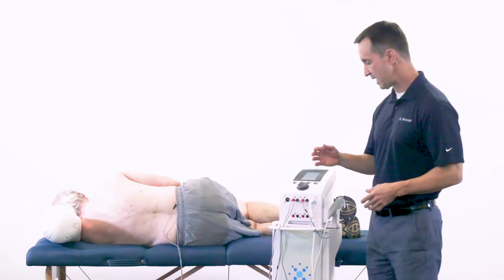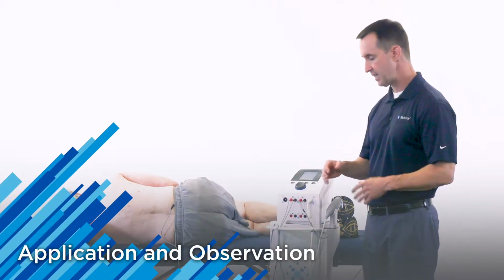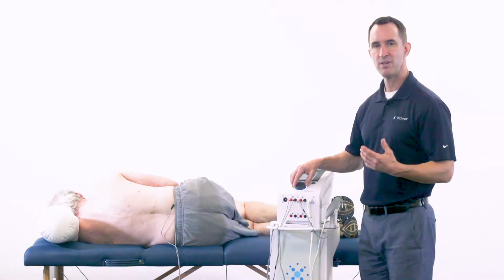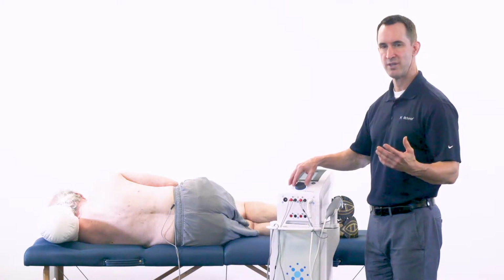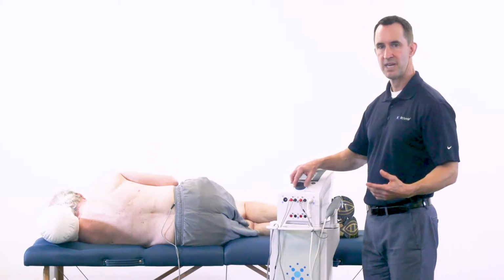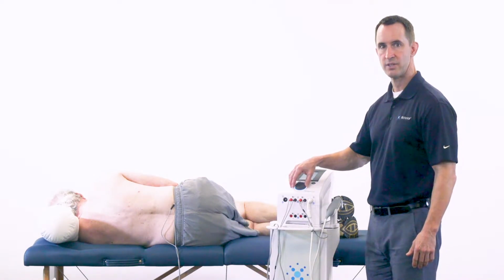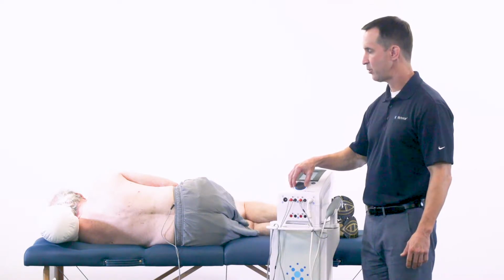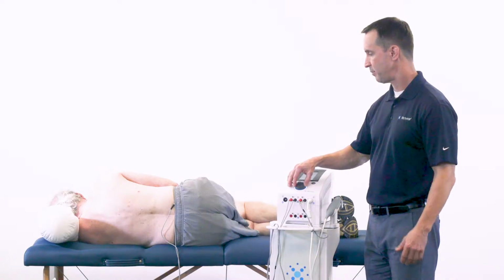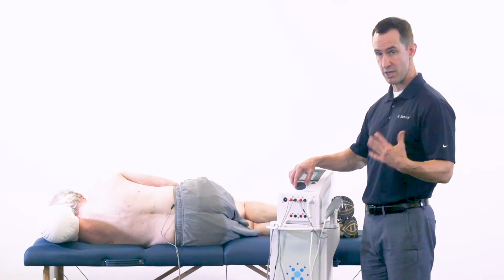So all I'm going to do now is push the amplitude button on the screen to highlight it. I'm going to increase the amplitude. I'm going to ask the patient now to let me know when he feels a strong sensory or tingling sensation. Okay, but I want to continue on to facilitate a strong submaximal contraction to make sure we have an adequate amount of stimulation to the muscle belly. I'm going to ask him to let me know when it's at a level he can tolerate.